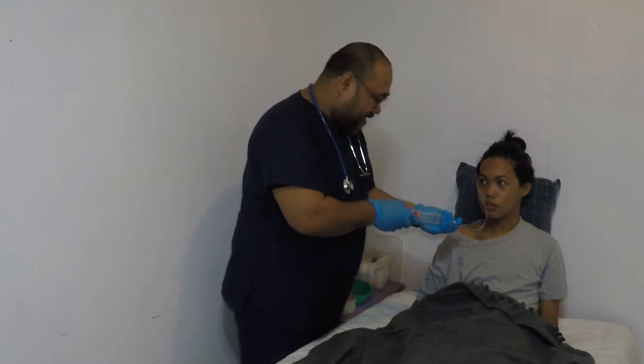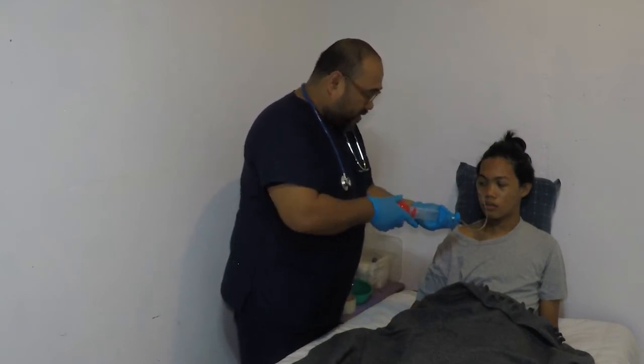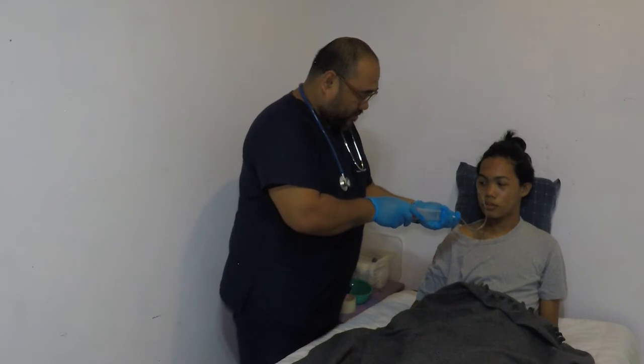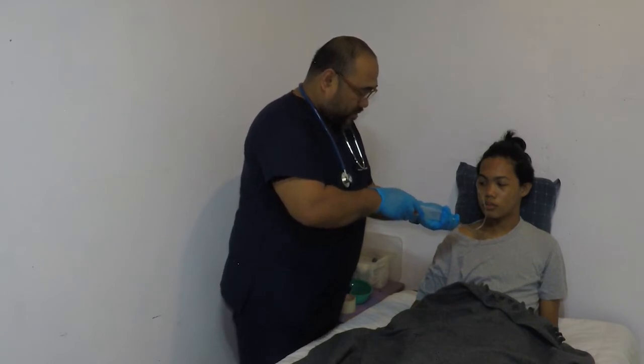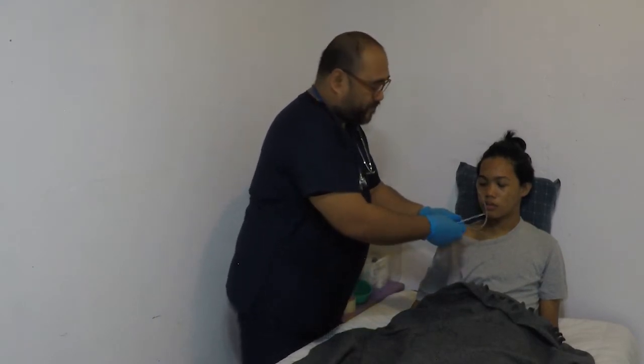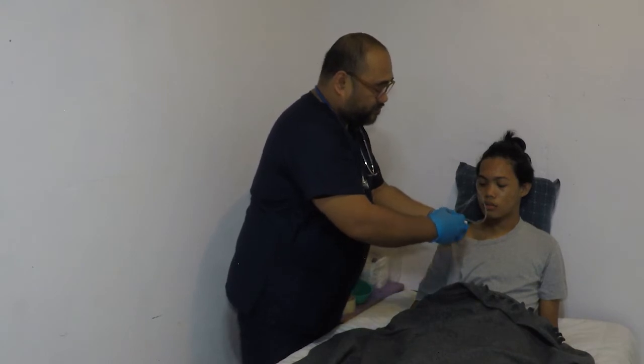Relax, because the liquid food is going inside your stomach. Okay, are you feeling okay? Then after finishing the feeding or the insertion of the formula, we have to clamp the tube.